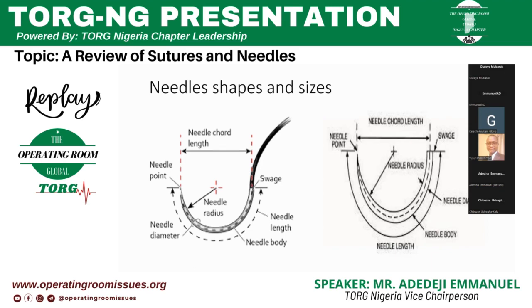You need different needles. It's not going to be the same needle points, and it's not going to be the same diameter. You don't need a diameter that is too thick, that will leave a space in the tissue when you are suturing.